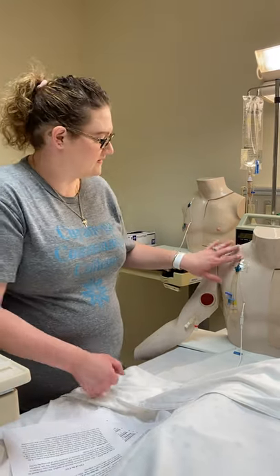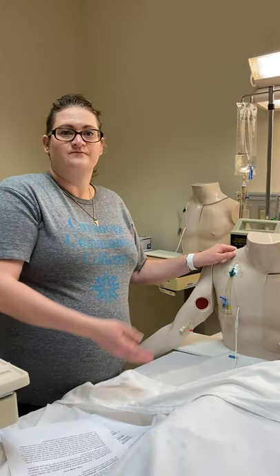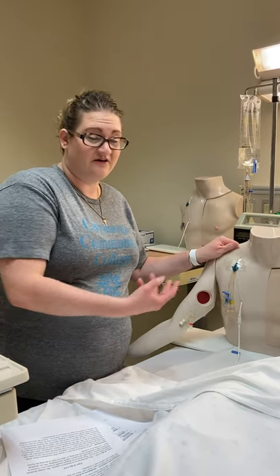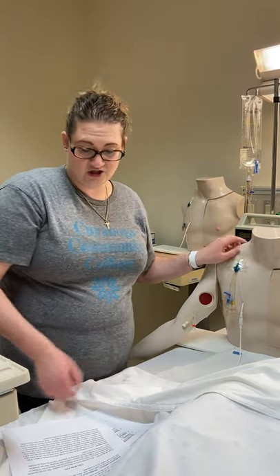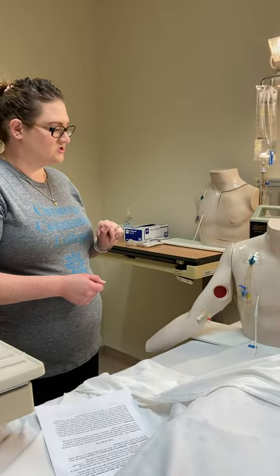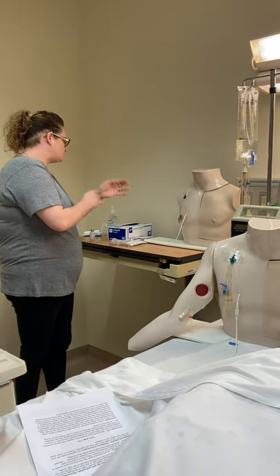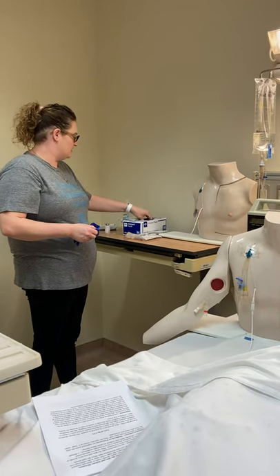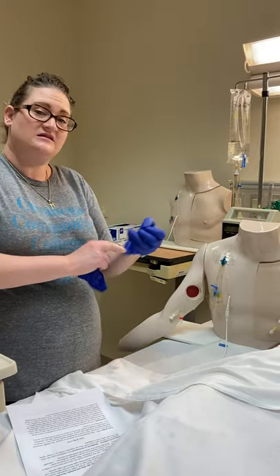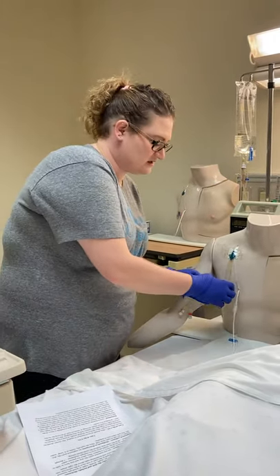We want to make sure these lines are patent at all times. The difference with a central line versus a peripheral line is you want to get blood return when you go to flush for patency — you have to pull back to get blood return and then flush; otherwise we don't want to be using it. This dressing definitely needs to be sterile when doing a dressing change. If the dressing is lifting, change it right away. Notify the provider if you see any signs of infection. If we're not using the lines, they should be clamped.